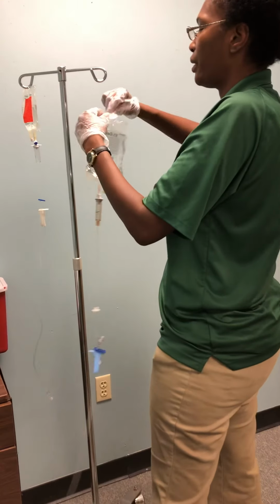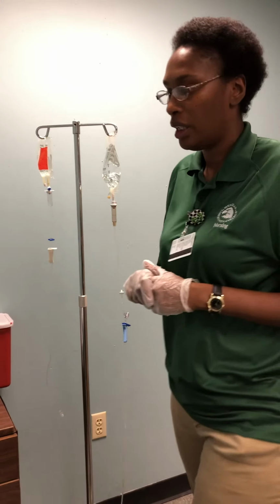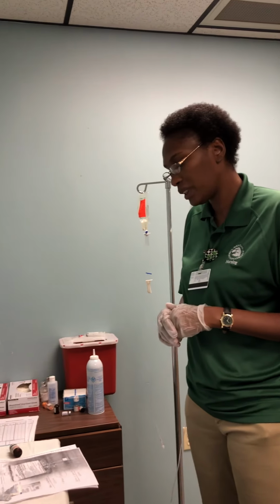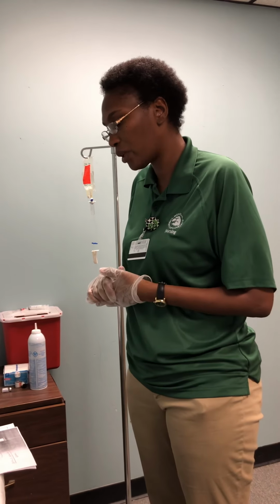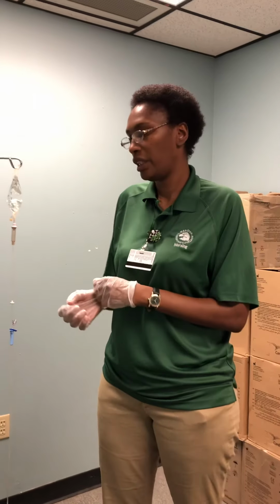Raise my primary bag and recalculate it back to the previous flow rate. I will leave my patients comfortable, bed at the lowest position, side rails up ×2, and wheels locked, and I would remind my patient to call for assistance. That's the end of my video.